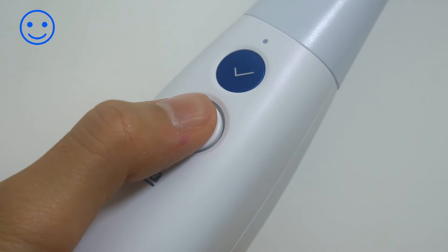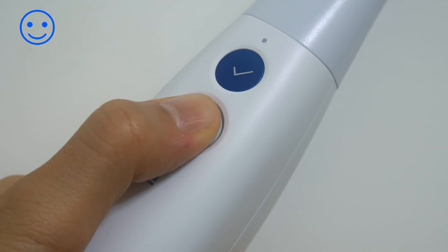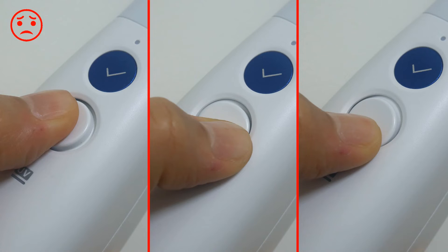If you press and hold the control button in the center and the scanner does not produce three short vibrations, you may not have pressed the control button correctly. Try again to press the exact center of the control button.